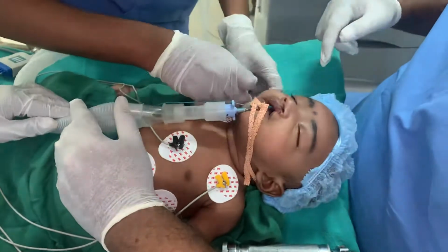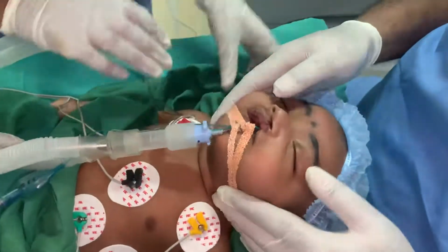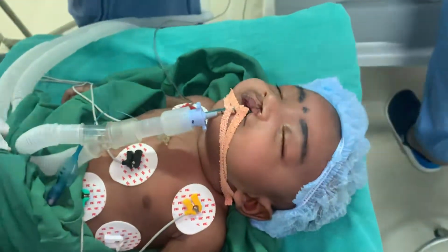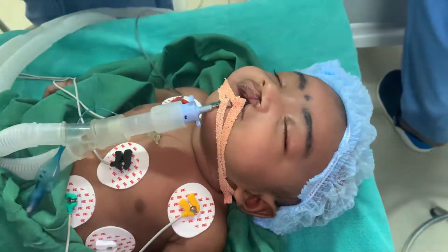Fixing the tube in the right position so that it stays firm. We're using a Dynoplast. So now the throat packing, the last step.